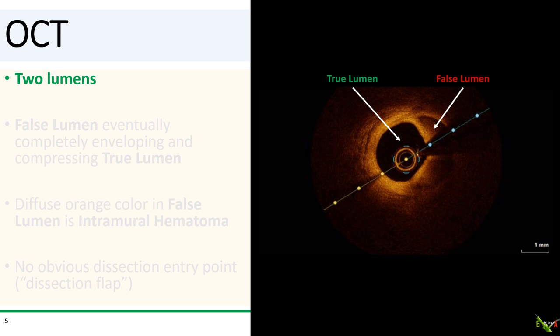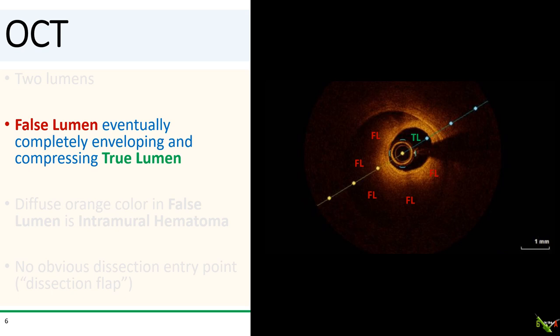So, here are the two lumens. You can see our OCT catheter in the true lumen and the crescent-shaped false lumen next to it. Further down, the false lumen has gotten a lot bigger and is completely surrounding the true lumen and compressing it. The diameter of the true lumen here has been compressed to just 1.5 millimeters. Remember, this is the high mid-LAD — it should be a lot bigger. The false lumen here is about 4 millimeters.